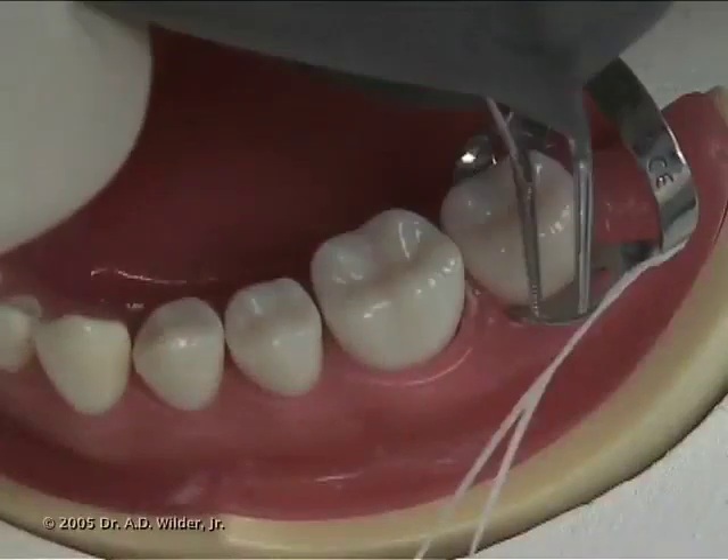Next, pull the ends of the floss through the hole corresponding to that anchor tooth.